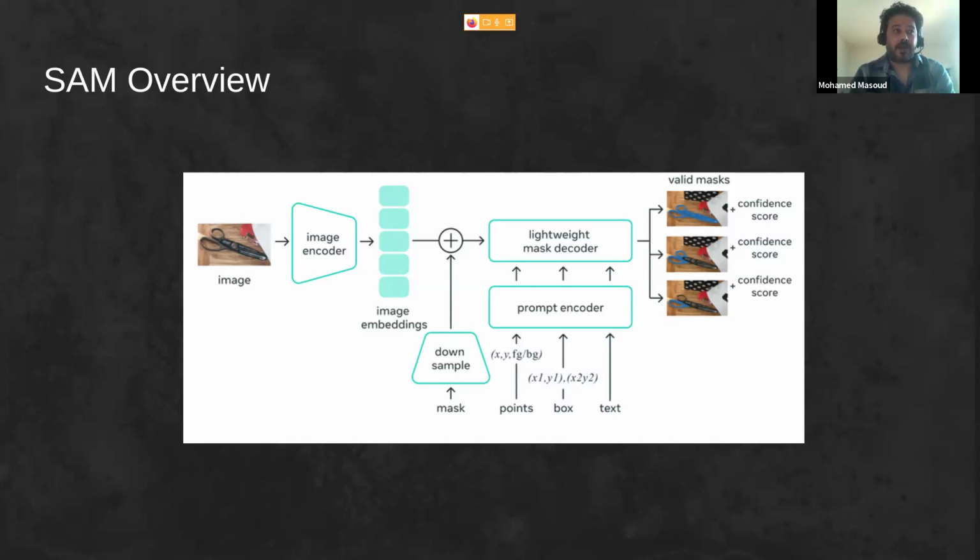So finally, once all of these things come together, there is a mask decoder in this case. In the mask decoder, it uses cross attention to fuse the image feature and the prompt feature. Started from there, there is a process using upsampling to retrieve the original image again, and then it goes to the sigmoid activation function to get the predicted mask in the end. So this is actually it, the overview.